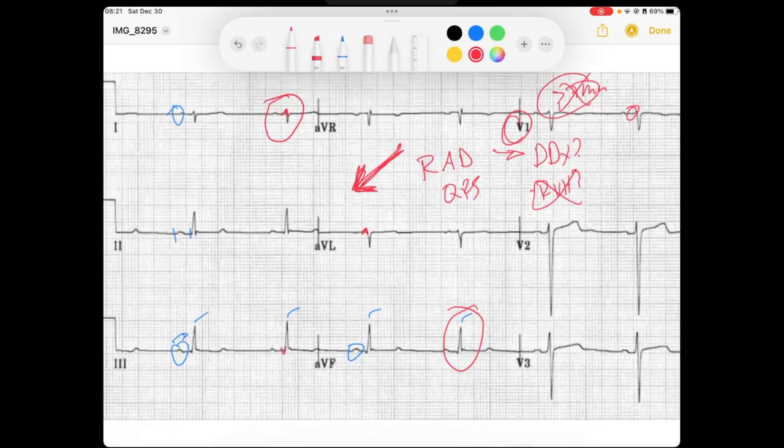On the other end, it creates a small Q wave in the inferior leads, which I see in my inferior lead. And then as depolarization, now we get our wave spread just after that occurs towards the region that was supplied by the posterior fascicle, which is the inferior septal, kind of posterior aspect. So we're going to get deep S waves that are away from those high lateral leads and towards those inferior leads here.